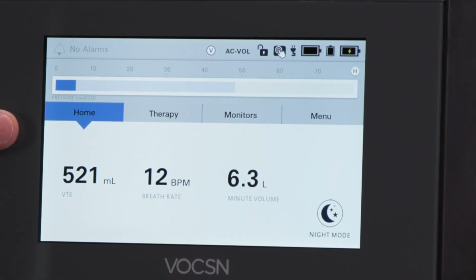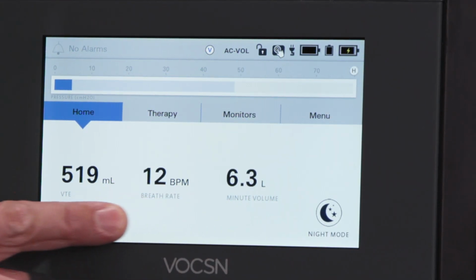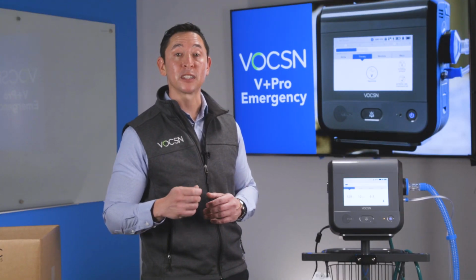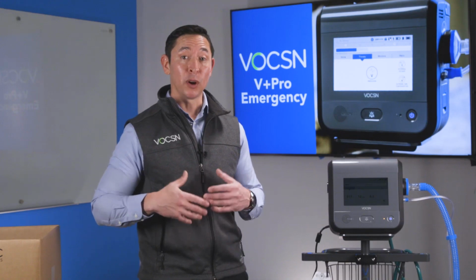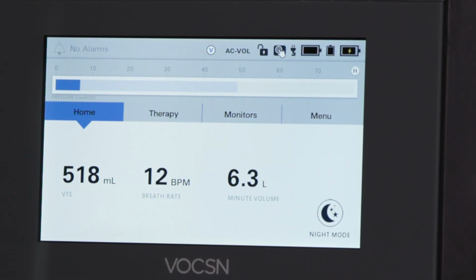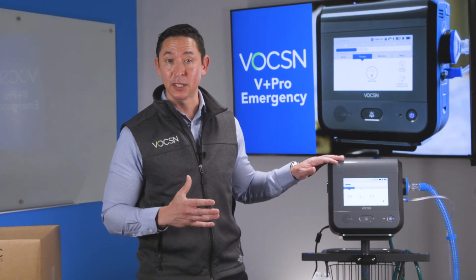So as I move down, you're going to see four navigation tabs. We have a home tab, a therapy tab, a monitors tab, and a menu tab. Currently, right now, we're in our home screen. So we have three parameters displayed right here. You can customize what those parameters are, and I'll show you how to do that once we get to the monitor screen. We also have a night mode, so we can dim the screen if that screen gets too bright for you at nighttime. If you want to illuminate the screen, you simply touch the day mode icon, which is just right there. Now, if I want to get access to any of the therapies that VOCSN V+Pro has, I simply touch the therapy tab.